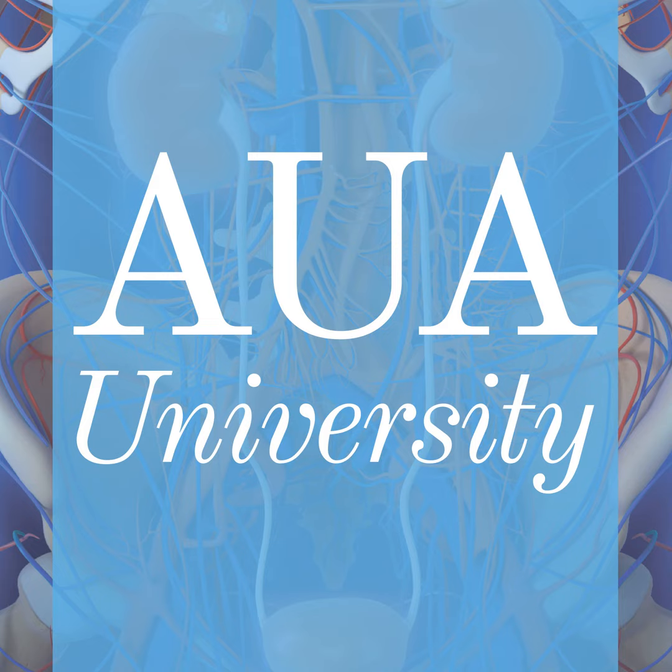And you can also go a little bit more into detail. You have a segmentation of the prostate gland, so your nuclear medicine people can give you the exact determination of where in the prostate this PSMA positive focus is located, and you can make your decision how to treat it: radical prostatectomy, radiation, focal therapy, whatever. We also have the different patterns of bone involvement: just a solitary metastasis, oligometastatic disease, or advanced disseminated metastatic disease. And also with regard to the lymph nodes, there's a specific classification system giving you the idea where exactly those lymph nodes might be located anatomically, and this will help in the treatment decision process.